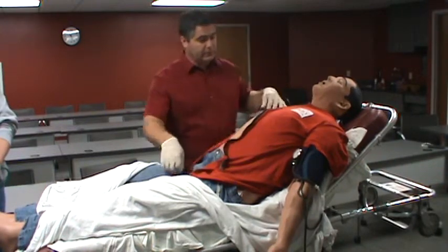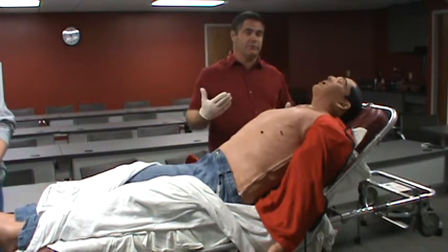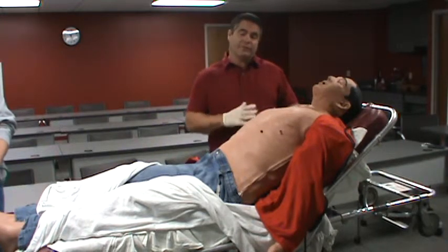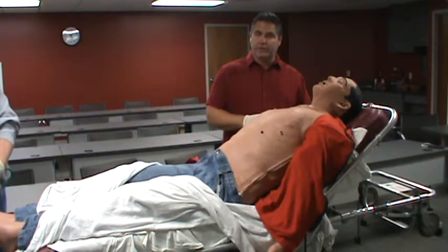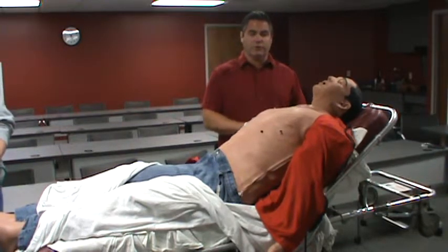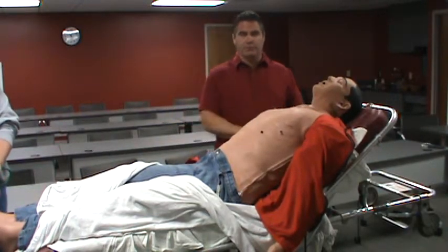He does have speakers underneath his skin for lung sounds, and they're also on the back if we were to have the simulator on the side or sitting him up. The simulator can't be set up bolt upright like you would find with a patient with difficulty breathing, so when you come into the simulation lab, we may tell you the patient is technically sitting bolt upright, but you're going to find him at a 45-degree angle at the most. Some functions are lost if we were to sit him completely up.